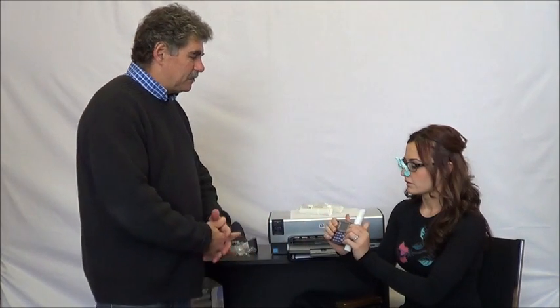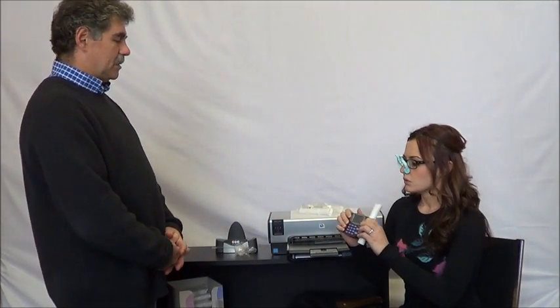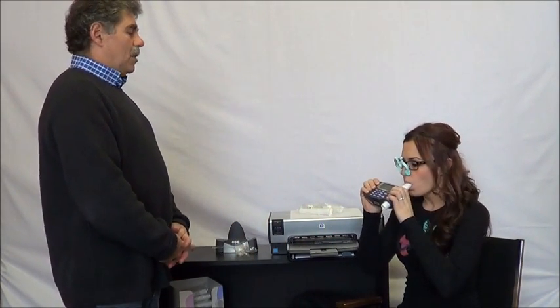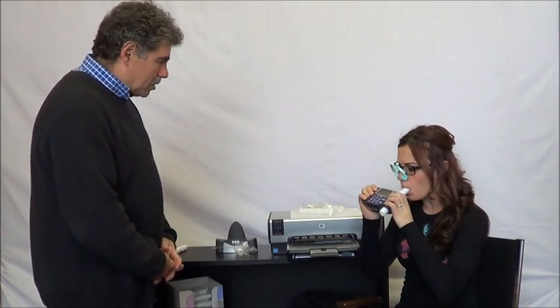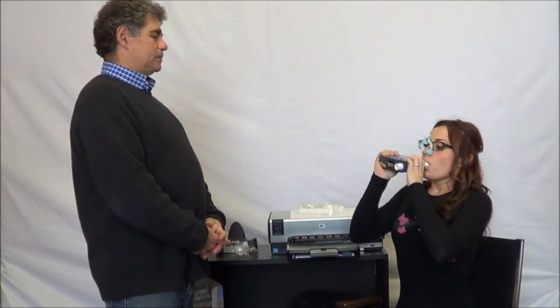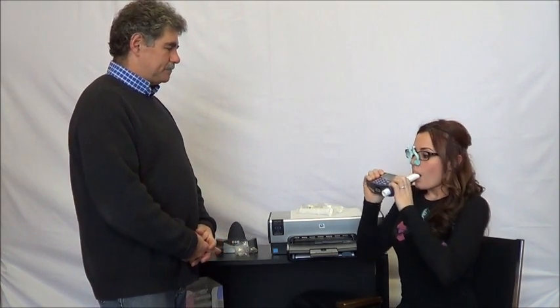Ask you to completely fill your lungs. When you're ready, blast — go, go, keep going, keep going, keep going. Big inhale. Good job.